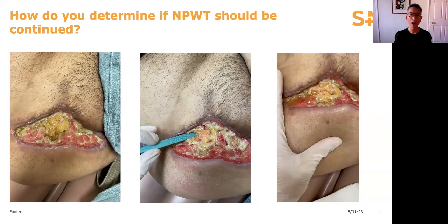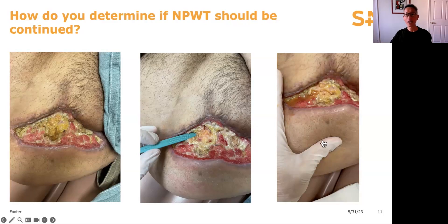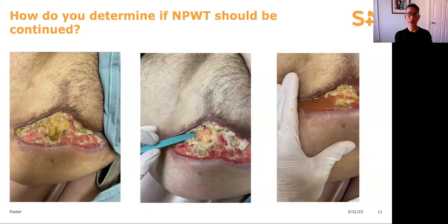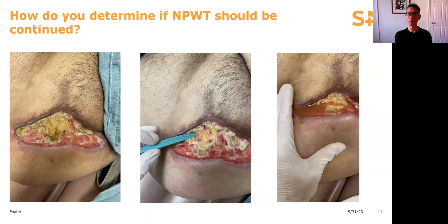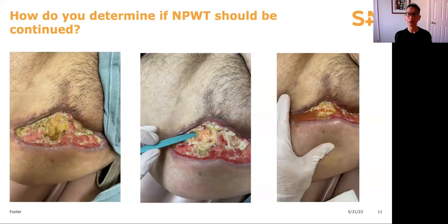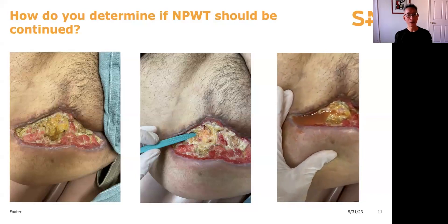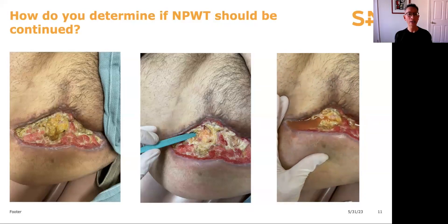When I looked at this wound, I thought we needed to clean up some of the non-viable fatty tissue. Using a curette to explore the area, I was able to evacuate and drain about five cubic centimeters of fluid from a cavity. This is a good reminder: don't always think about continuation of therapy just because it's being used. We can all echo that.